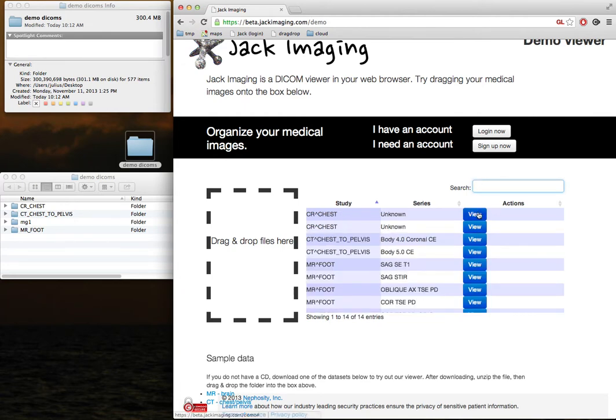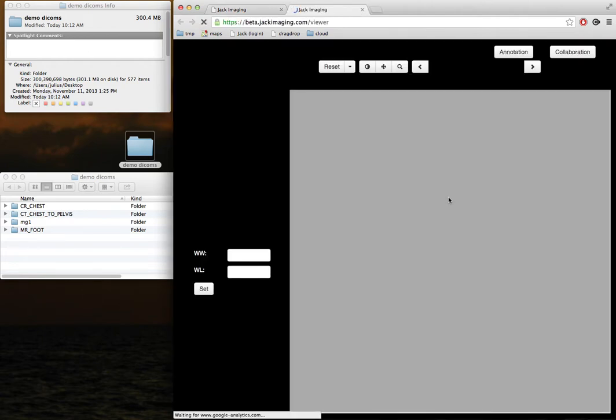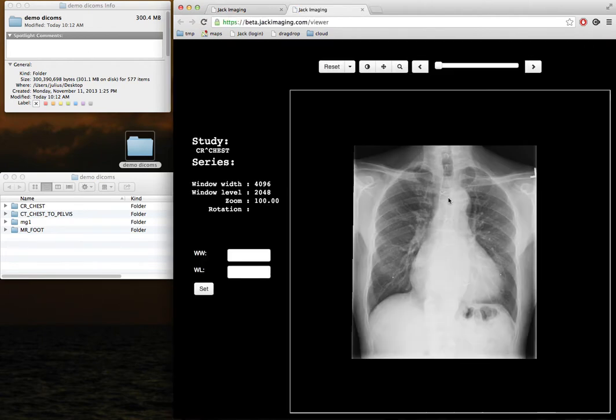In order to view a series, you just click on the View button, which will bring you into our viewer.